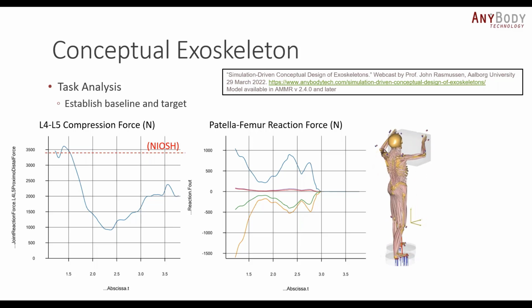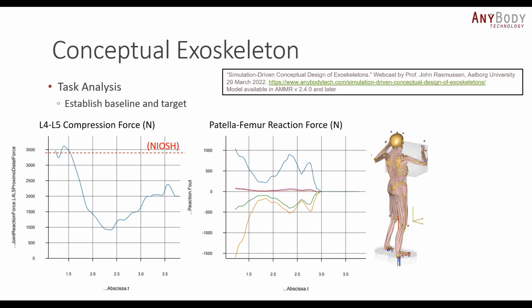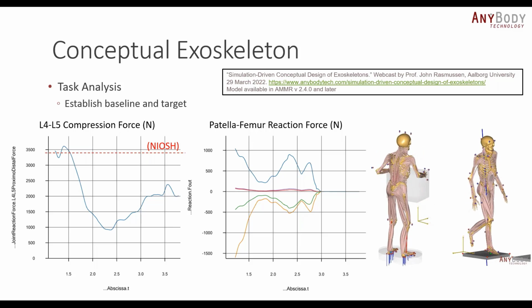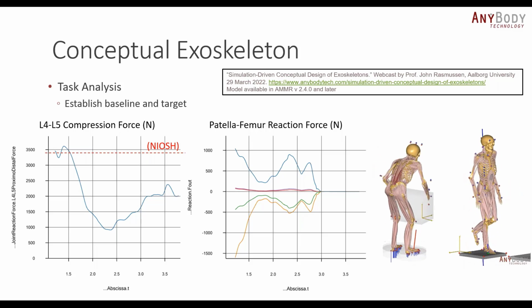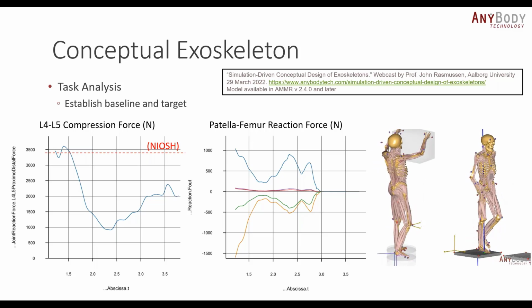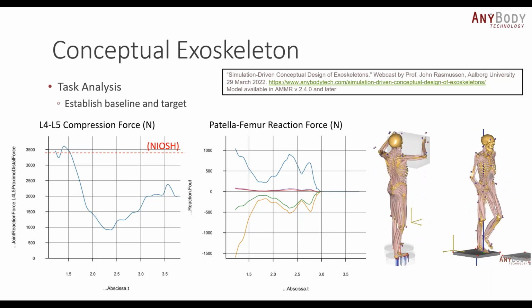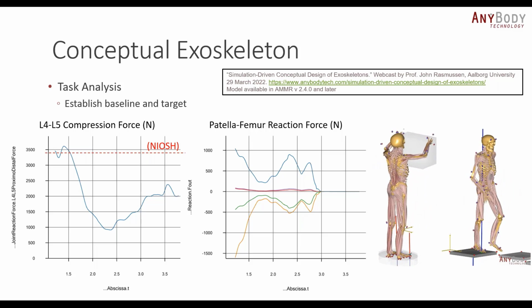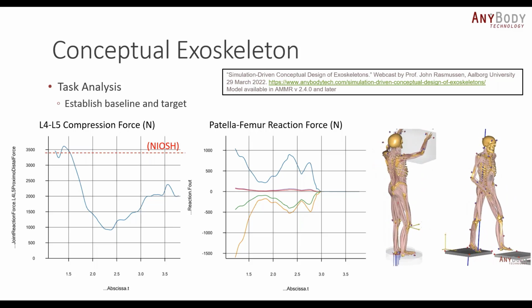In this case, Professor Rasmussen suggested that when you don't have a recommendation available from some source, then it could be interesting to consider activities like gait, with the idea that we have evolved over thousands of years and we are very efficient at gait. We can do several thousand steps every day without causing any kind of long-term damage to our body. So the reasoning is that the loads we see in such an activity must be safe, and that can be considered as a target level or reference for the patella-femur reaction force.